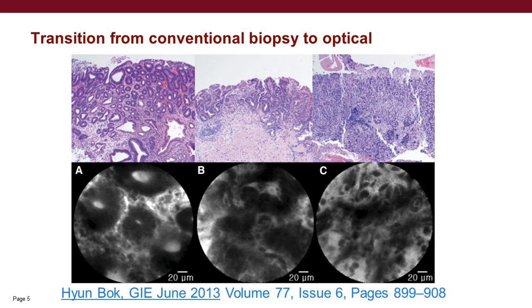And one other thing I want to note is the markers are changing in fluorescence endomicroscopy images. Where you might have looked at tissue morphology in the top images, you may look for more cellular level indicators like nuclear crowding or cell wall thickness.